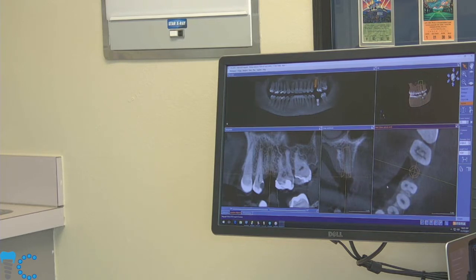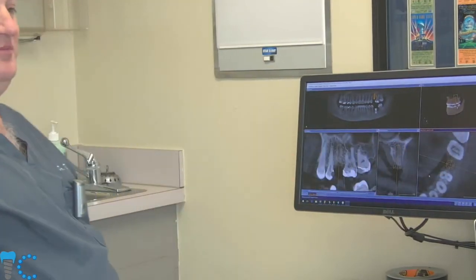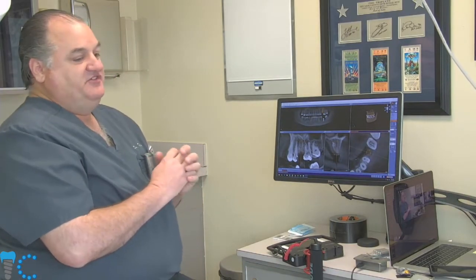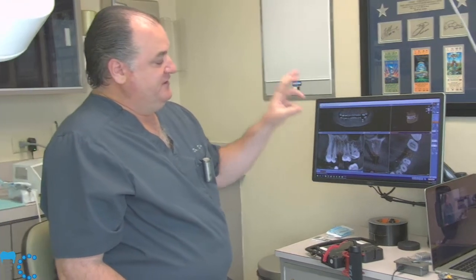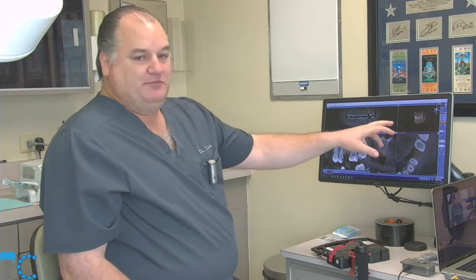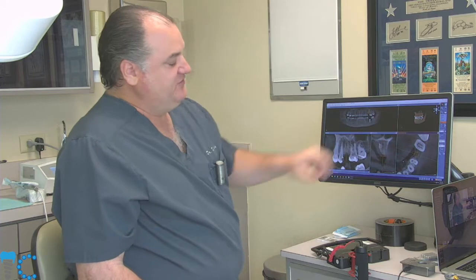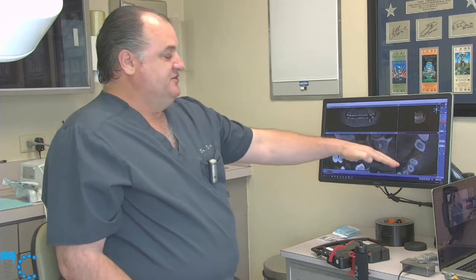So our implant positioning is very important here, because again, we do have about 1.5 millimeters to 2 millimeters of space on either side of this tooth. The idea of an implant restoration is to design our implant placement so that the patient's occlusion, their function, is functioning on this restoration in a way that puts a compressive load on our implant. So we want our implant crown to be well centered over the implant without large buccal overhangs, large interproximal overhangs.